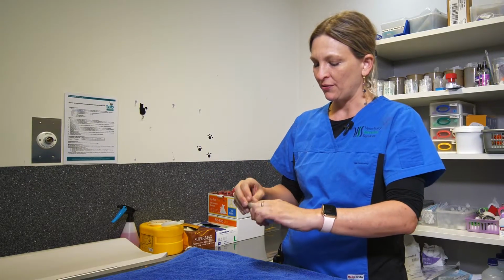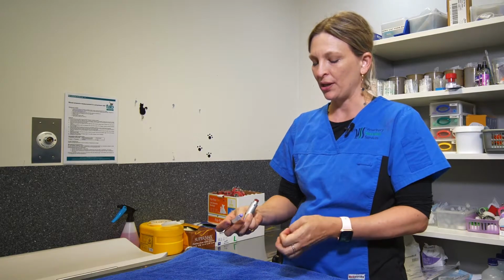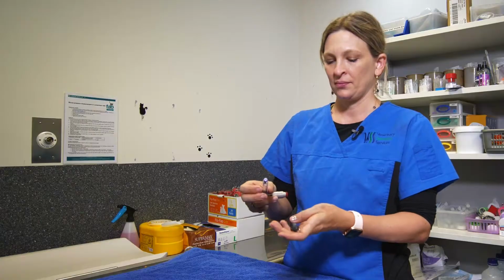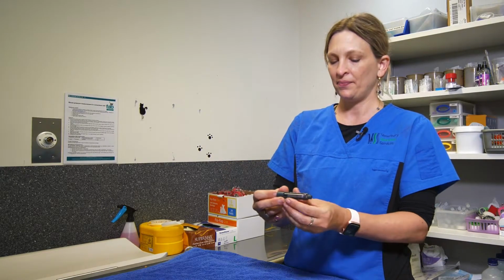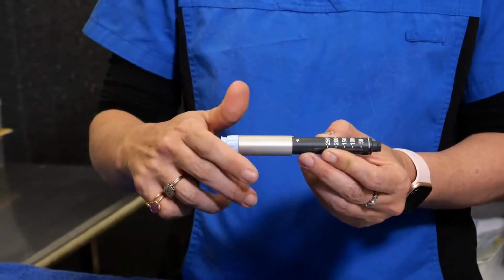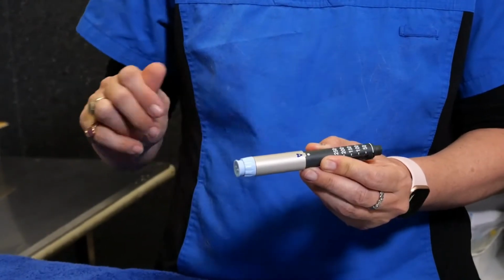So when you receive the pen, take the lid off. This pen has been preloaded with a cartridge of insulin, but this is what your insulin cartridge will look like. Insert that here, and you'll find that the pens will come with a very detailed data sheet as well. Screw this together, and you want to make sure that these two stars are aligning here.